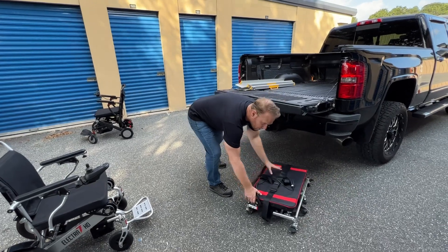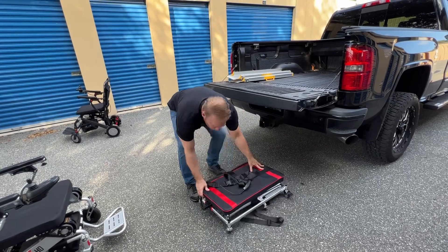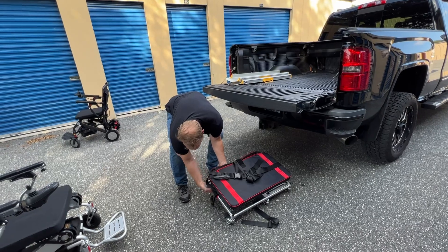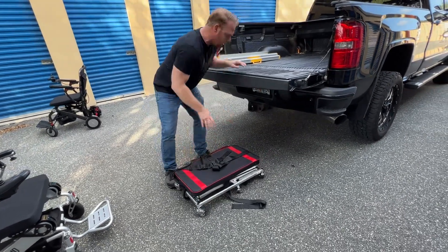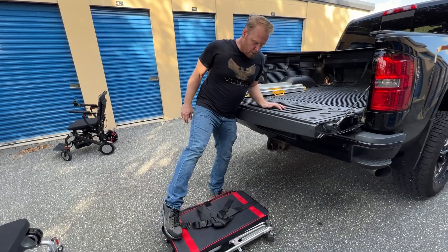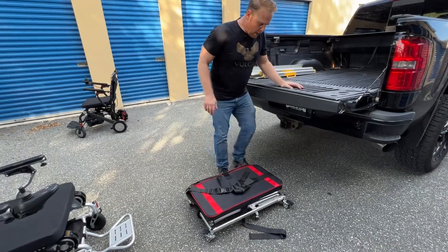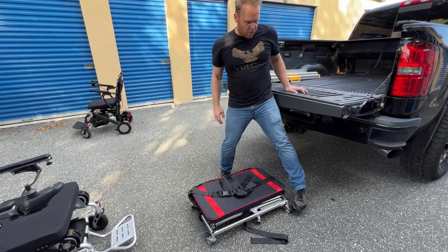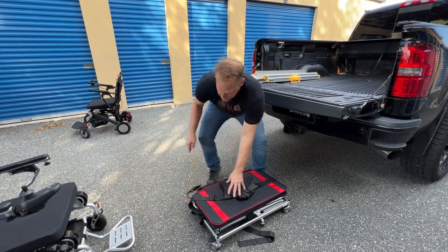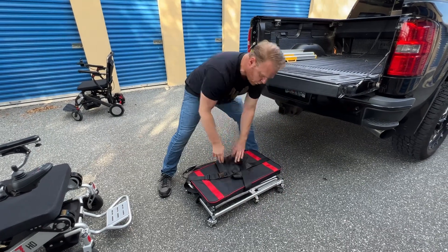The first thing I'm going to do is unlock the Vulcan — the Vulcan has lockable wheels. I'll get everything in position and I'm going to position the Vulcan just a little bit behind the actual bed of the truck. Then I'll lock down a couple of those wheels so the Vulcan doesn't go slipping and sliding around.